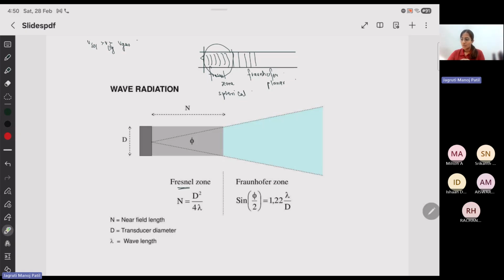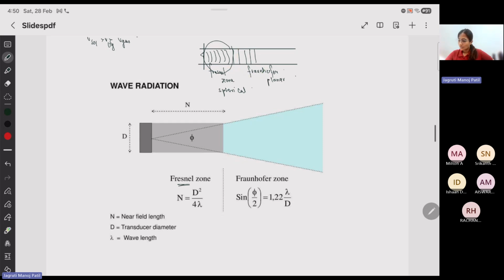So we never image whenever we are in the Fresnel zone. We'll always do and complete our approximations within the Fraunhofer zone. There are some approximations to it also, and the field there is also somehow called something where you look into the depth of field.